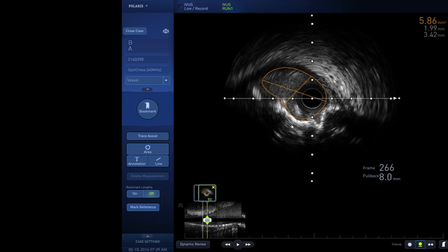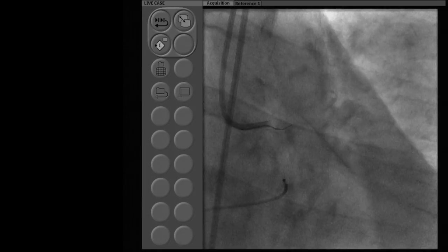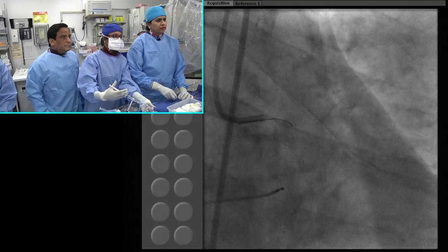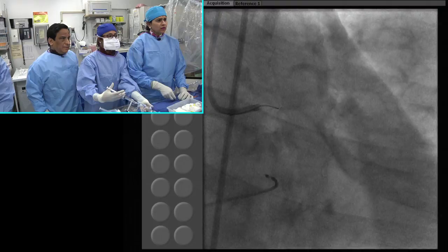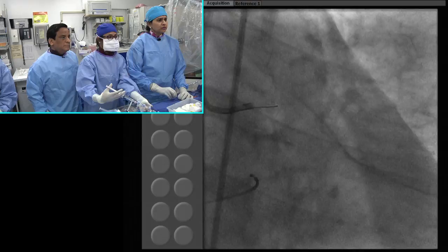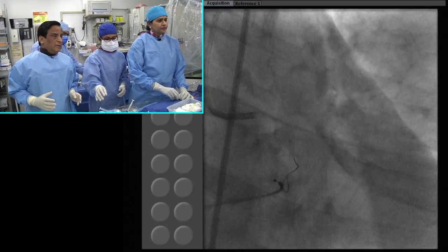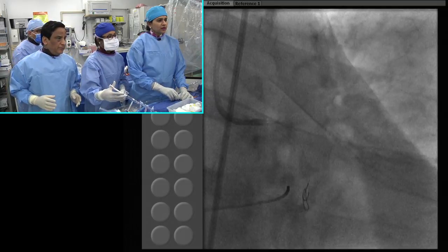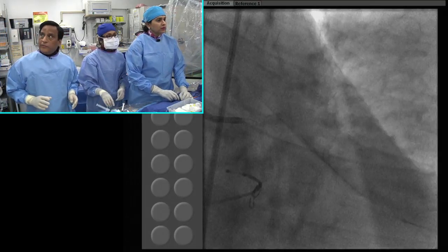Some dye. Hydrating is good, right? Yeah, this may require a Venture and other catheters to go into the circumflex, or maybe even very sharp and eccentric calcium. Let's do the rota, then we may be able to wire it. Okay, good. So clearly heavily calcific. There we go. Good. If it doesn't go further, let's just try. Okay, so we brought it back. I moved already, so we are trying now.